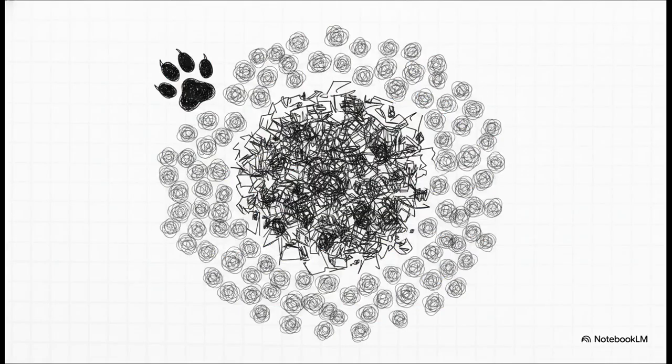Now, sometimes you'll be scanning the slide and suddenly, bam, you hit a sea of polymorphonuclear neutrophils, microabscesses, and necrotic debris. This is your classic suppurative pattern. Your brain is going to immediately scream bacterial infection. And you know what? You'd often be right. This pattern is a hallmark of ordinary bacterial lymphadenitis, or if you happen to see stellate necrosis, maybe cat scratch disease caused by Bartonella henselae.